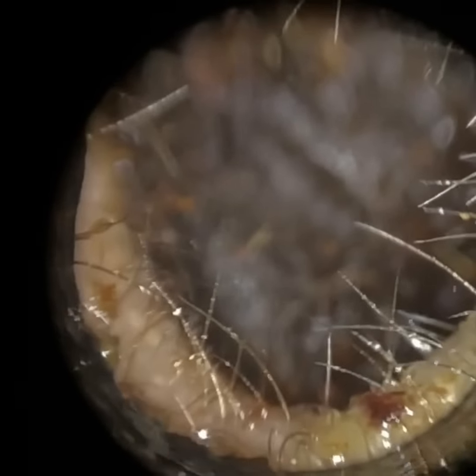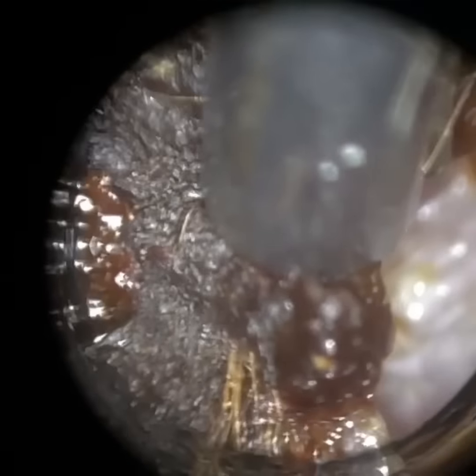So the view that you're experiencing with the WAXscope is very similar in terms of magnification to an ENT operating microscope. With an ENT operating microscope, you have binoculars really, so you're looking into the ear with both eyes. But it's not possible to visualize, for example, the eardrum at the bottom of the ear canal, which is about 2.5 centimeters away, with both eyes, because your interpupillary distance is too great to look at an object very small in the ear, deep.